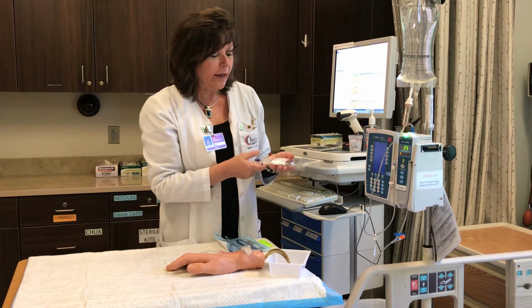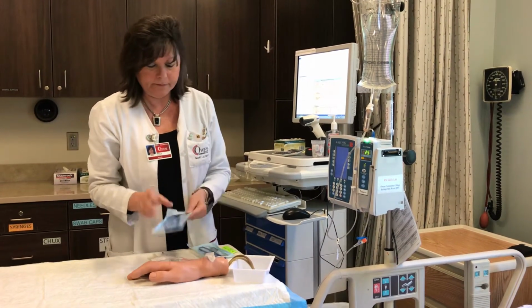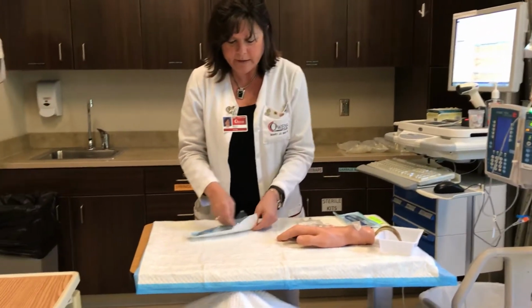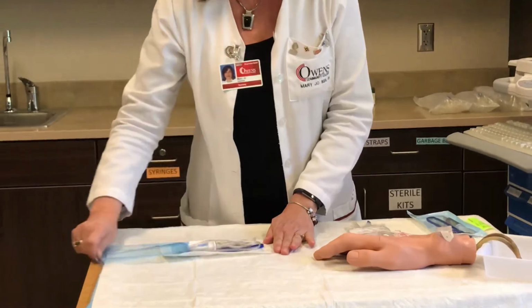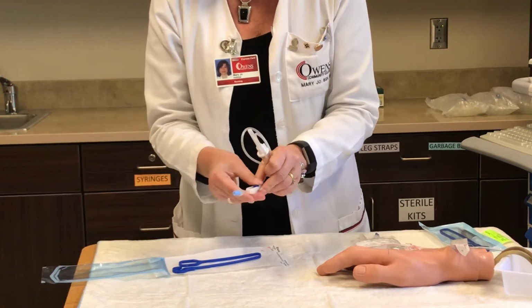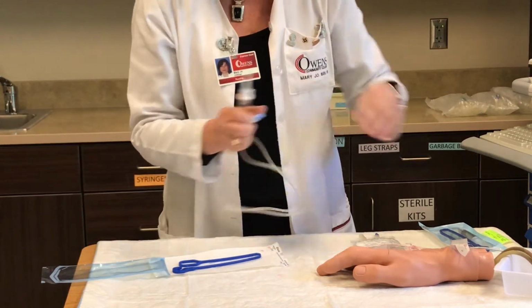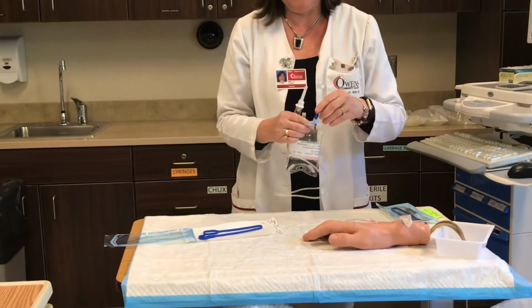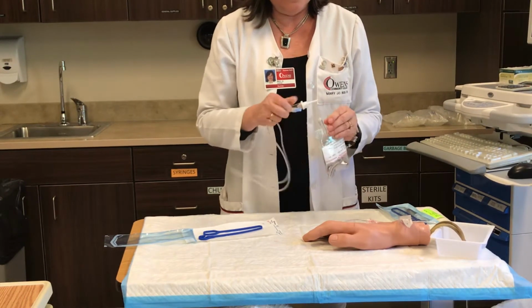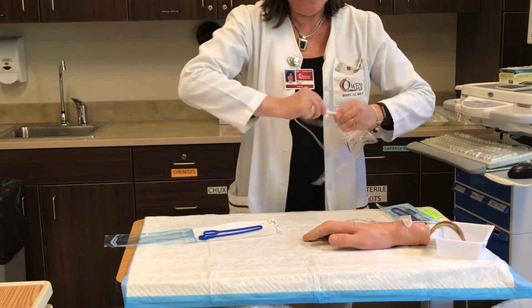No, I don't. Okay. Close the clamp on the IV piggyback tubing. When you open your secondary tubing, the first thing you want to do is close the clamp. Otherwise, all the fluid will run out and you'll lose that medication and it won't be the correct dosage. Connect the tubing to the IV piggyback bag. Maintain sterility of the two connections.